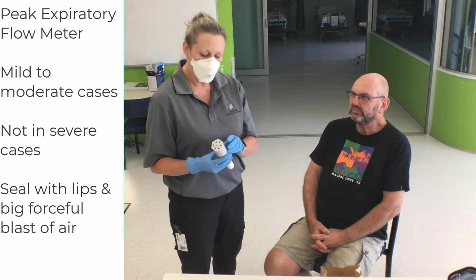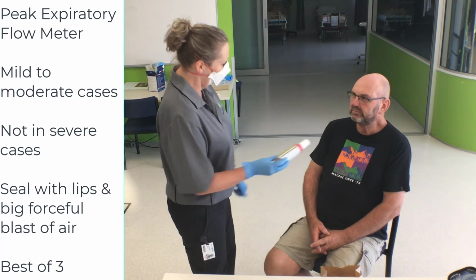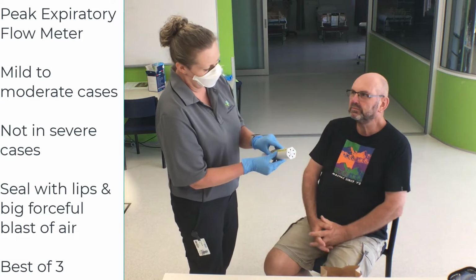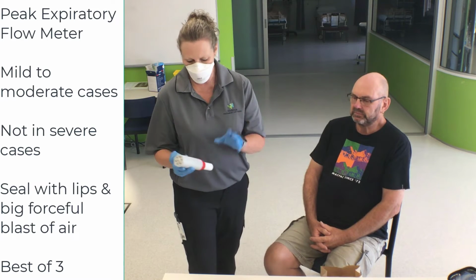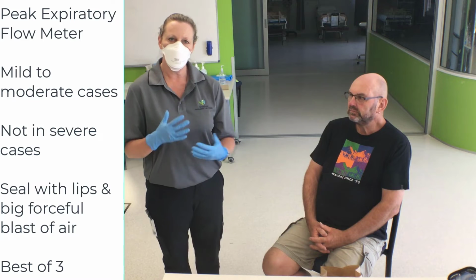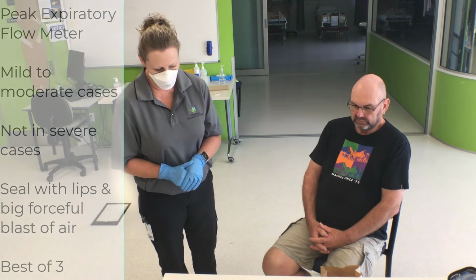We don't just do this once, we do take the best of 3. So once you've caught your breath again, if you could do that. And nearly at 600. So we're going to take 600 as our PEF today. So that means Don would be safe to leave at home if his symptoms resolved after treatment.